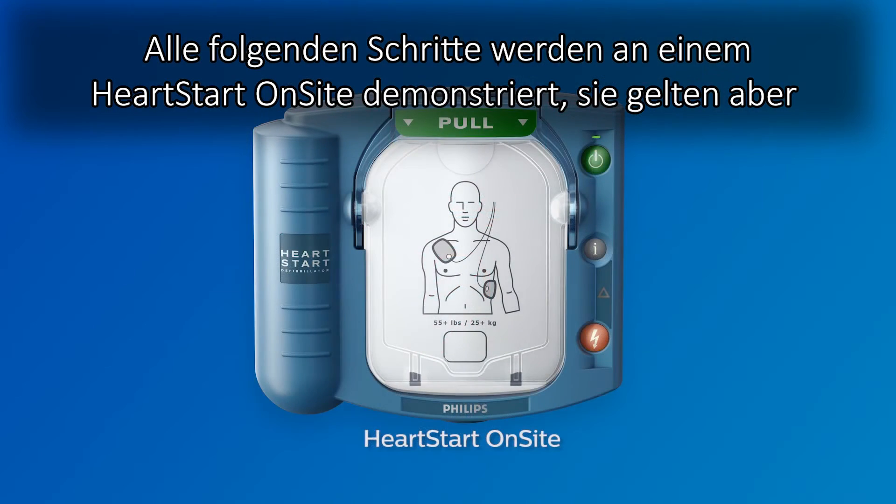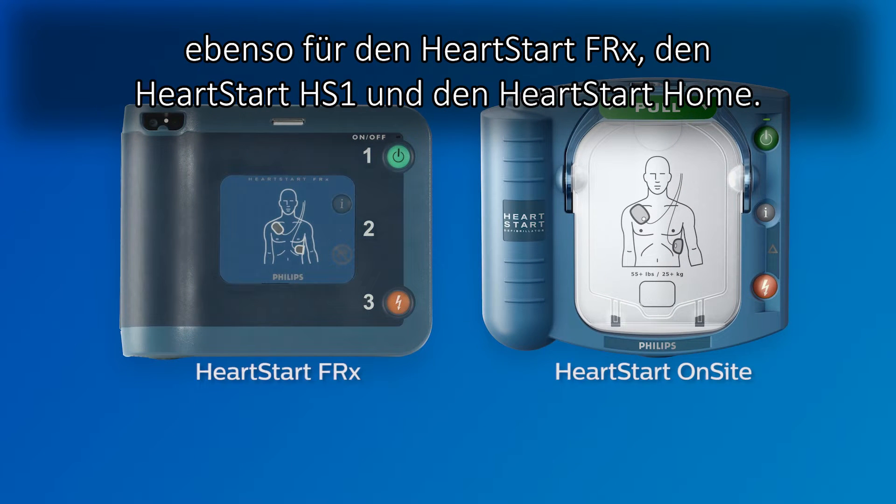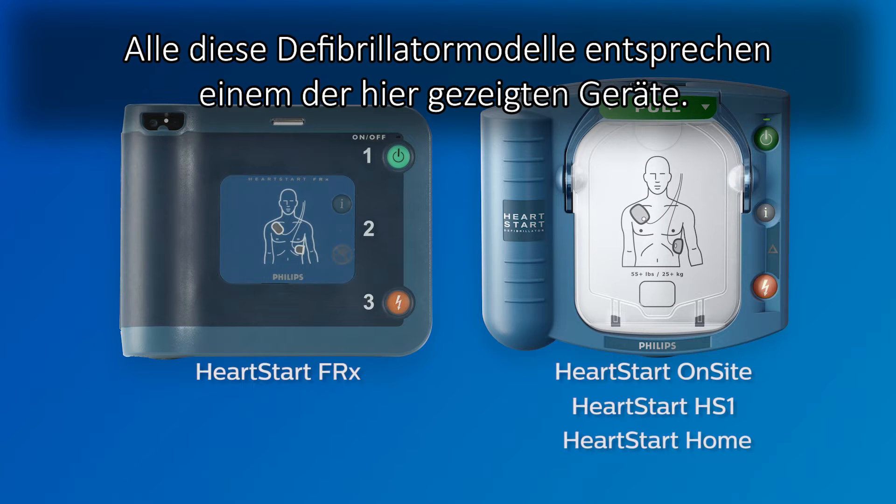We're using the HeartStart OnSight to illustrate these instructions, but they also apply to the HeartStart FRX and the other members of the HS1 family of defibrillators, including the HeartStart HS1 and the HeartStart Home. All of these defibrillator models look like one of the devices shown here.